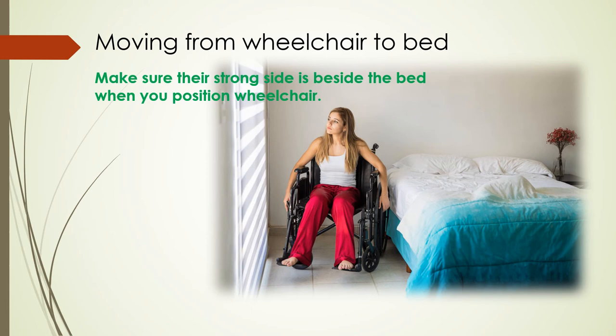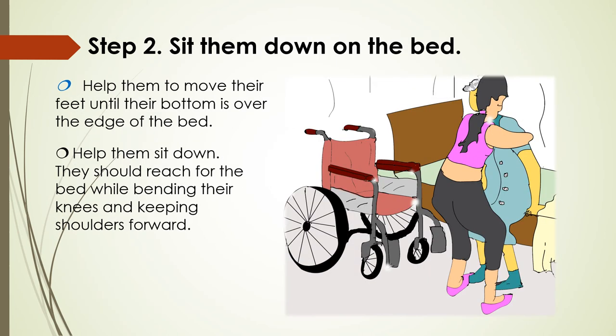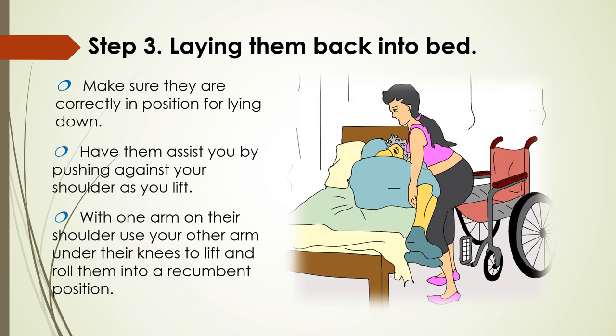First off, position them alongside the bed and stand them up out of the chair. Make sure their strong side is beside the bed when you position the wheelchair. Move the footrest out of the way and ask them to move forward in the wheelchair, making sure their feet are flat on the floor. Stand in front of them with feet wide apart. Get them to sit tall, ready to lean forward and push down on the wheelchair armrest when you help them to stand. Once they are standing, place your hands around their upper back and help them move their feet until their bottom is over the edge of the bed. They should reach for the bed while bending their knees and keeping their shoulders forward. To get them correctly in position for lying down, have them push against your shoulder as you lift. Then with one arm on their shoulder and your other arm under their knees, lift and roll them into position.